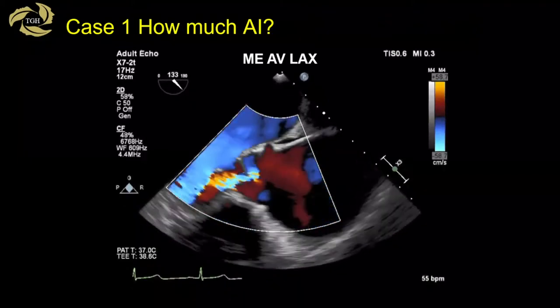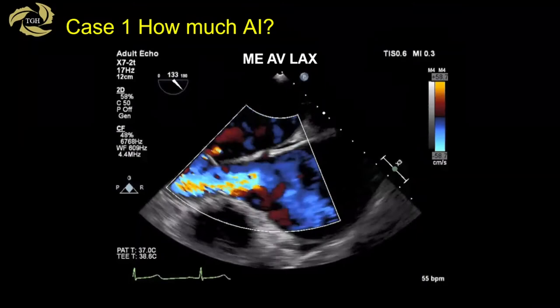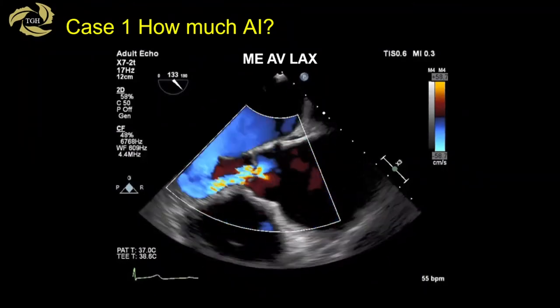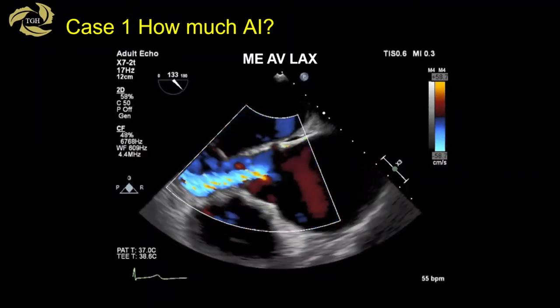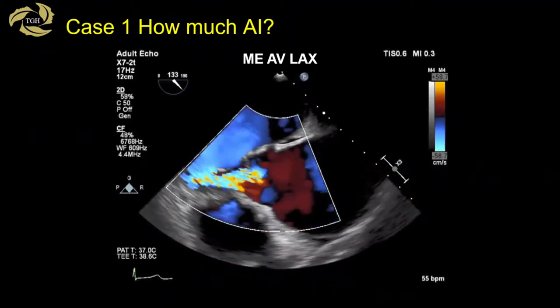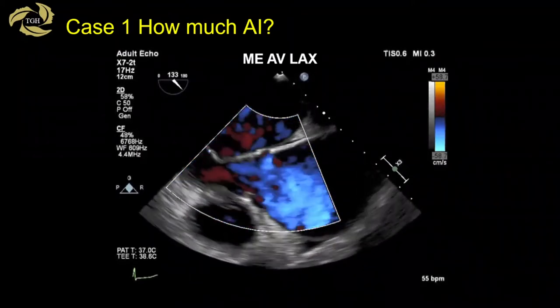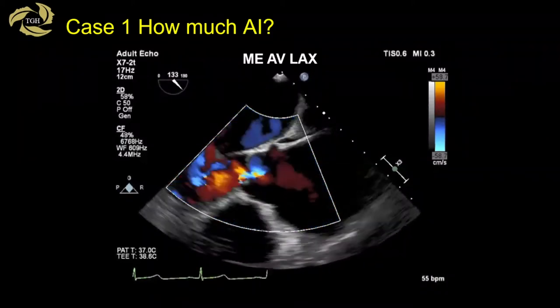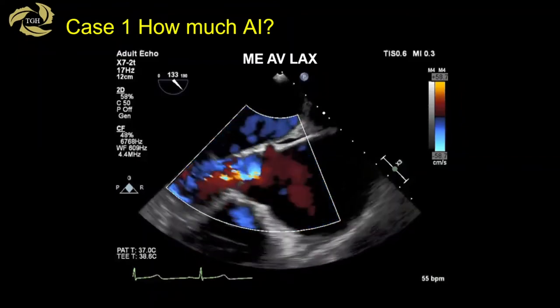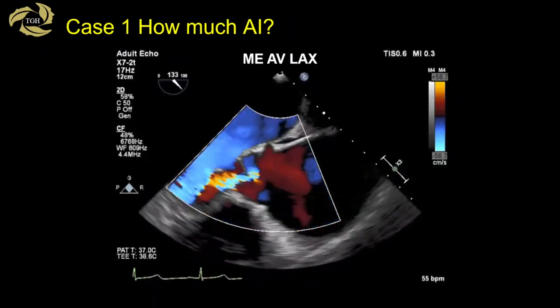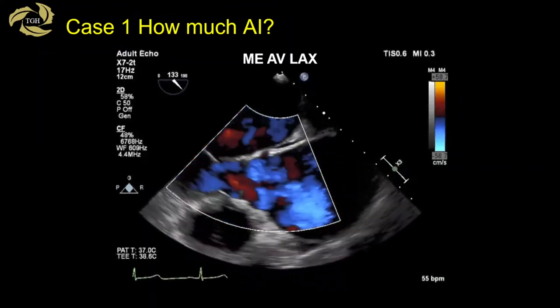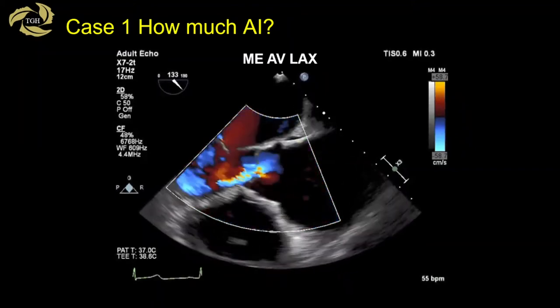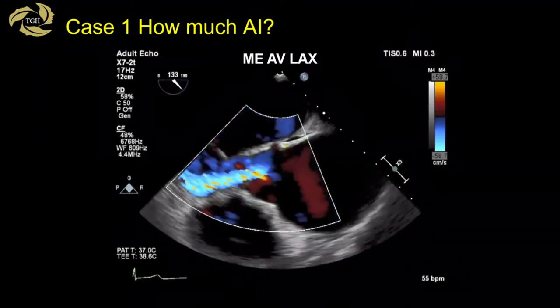When we turn color on, we can see that not only is the aortic root dilated, but the aortic valve is dysfunctional as well — there appears to be some AI. The question often asked is how much AI is there. It's probably moderate or possibly severe, but we'll need to look at additional parameters to determine the degree of AI.